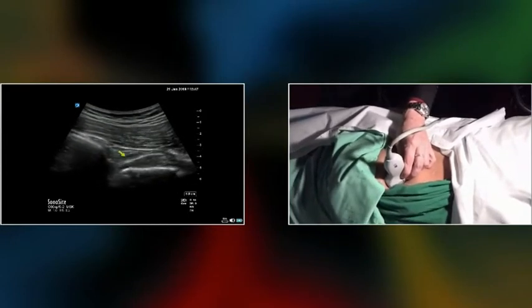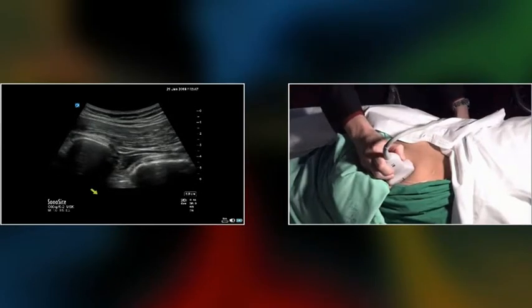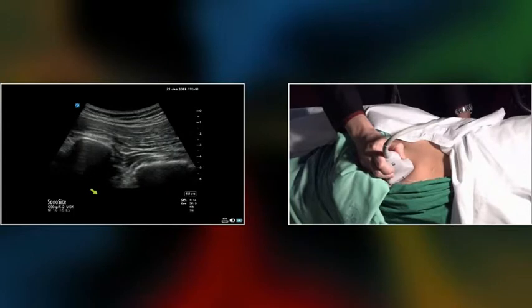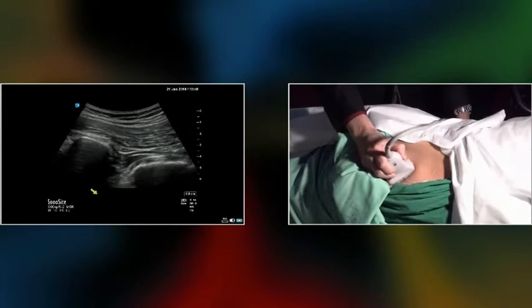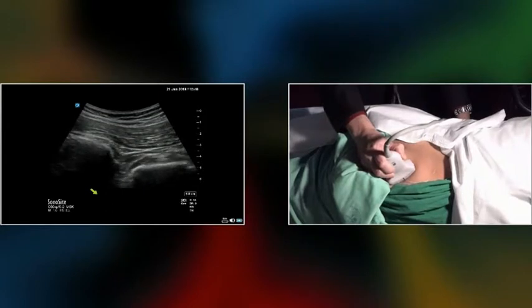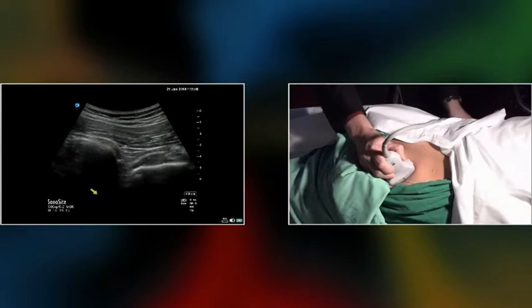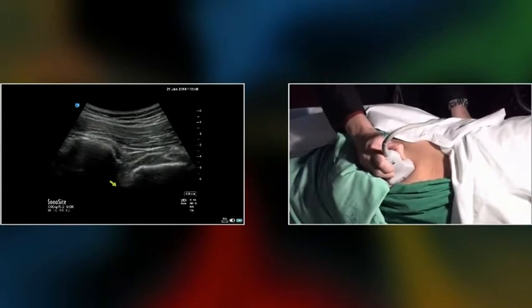You can see that it's not an equal thickness for the whole muscle. Usually the middle part, especially the middle 1/3, is the muscular part, and people tend to have the problem in this area more than the lateral part. And keep in mind that the bone on the right lower corner is the ischium bone.